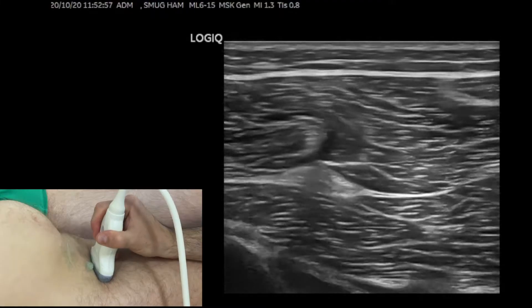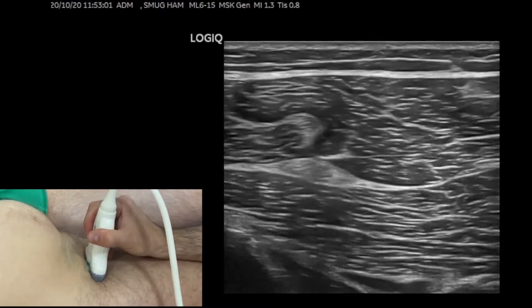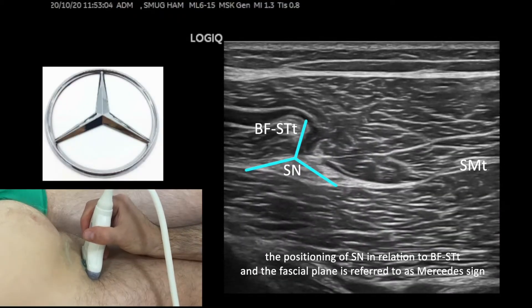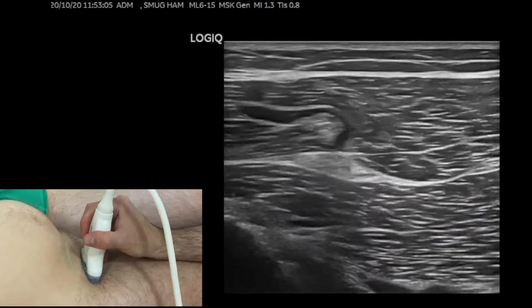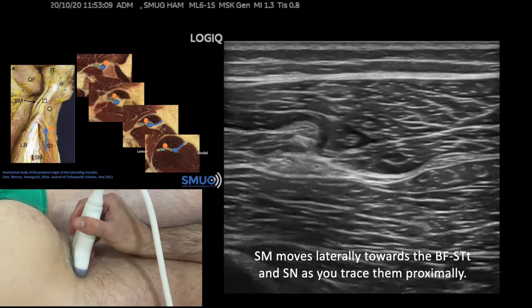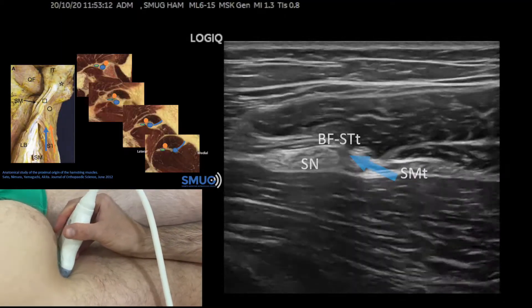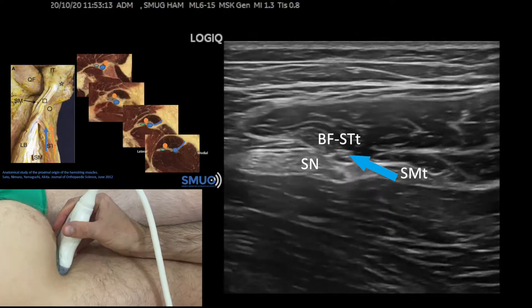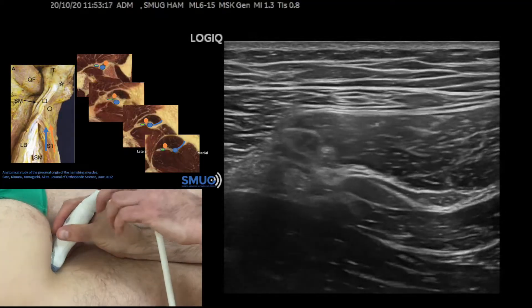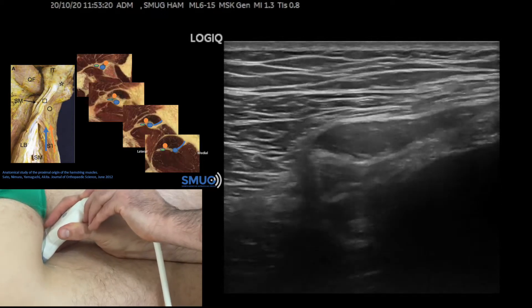Now once we have identified all the structures, we're going to move the probe proximally to see if we can follow them up to the attachments. So the conjoined tendon and the semimembranosus tendon — we're going to move slowly towards each other as we go proximal. The sciatic nerve stays where it is, and we go up until we reach the bone and the attachment.